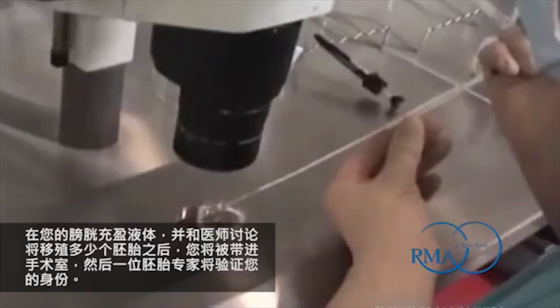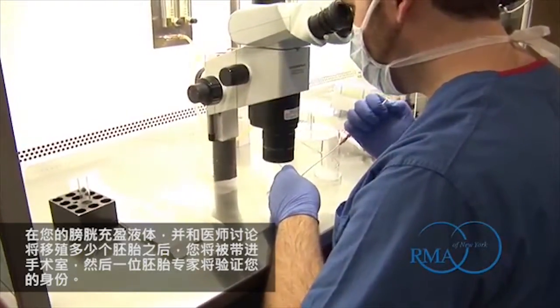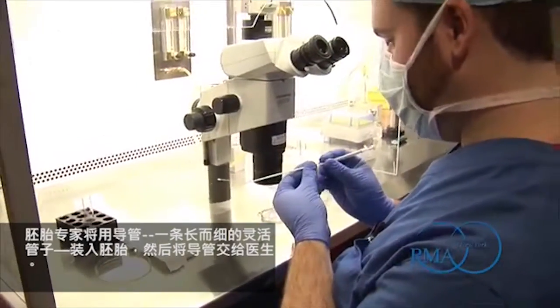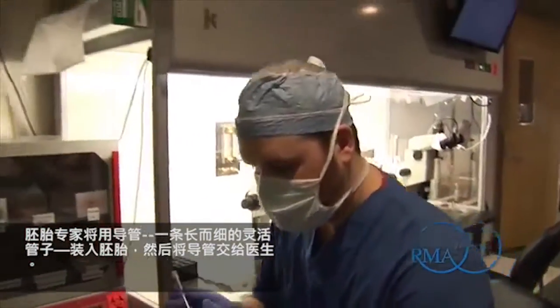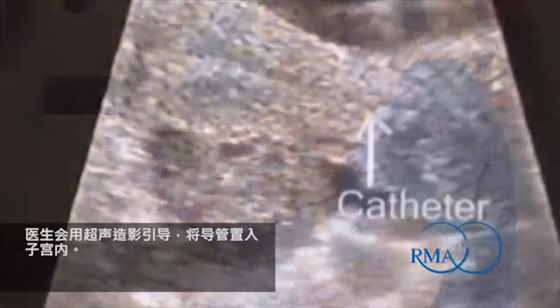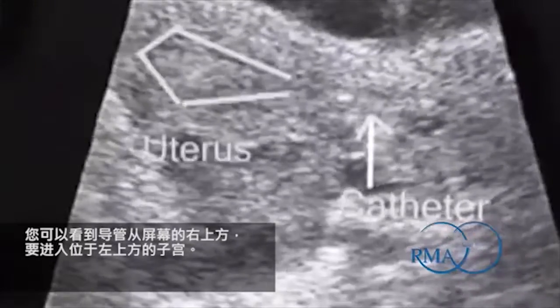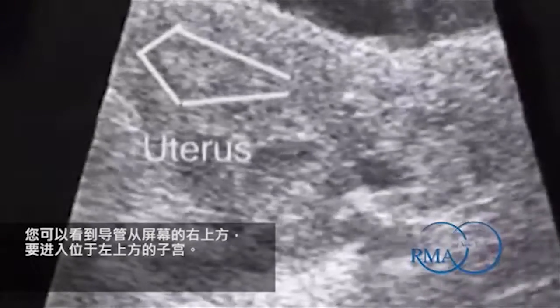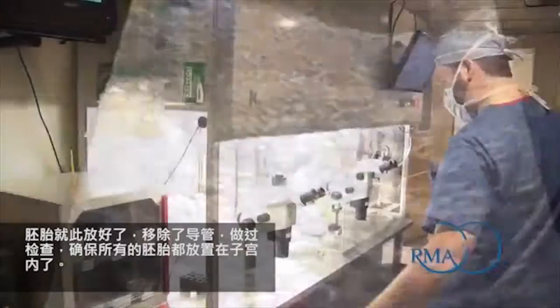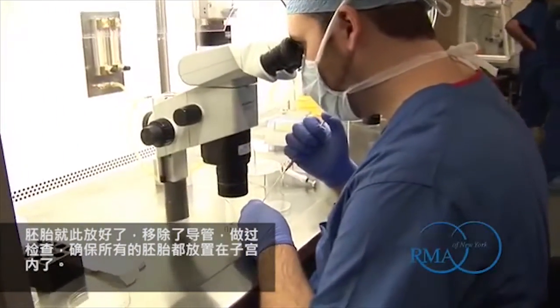After you have filled your bladder and had a discussion with the physician about how many embryos will be transferred, you will be brought into the operating room and an embryologist will verify your identity. The embryologist will then load the catheter — a long thin flexible straw — with the embryos and hand the catheter to the physician. The physician will then guide the catheter into the uterus using ultrasound visualization. You can see the catheter on the top right side of the screen making its way into the uterus which is on the top left. The embryos are then deposited and the catheter removed and checked to make sure all the embryos were placed in the uterus.